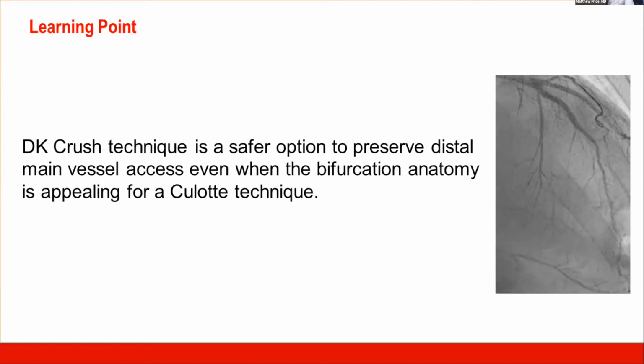We never really did a ton of stent, but you want enough so that in your mind's eye, if you deploy that side branch stent, the proximal segment would be completely within the main vessel itself, however many millimeters that might be based on the angulation of the side branch. Would that be about right, Tanvir? Yeah, I think so.